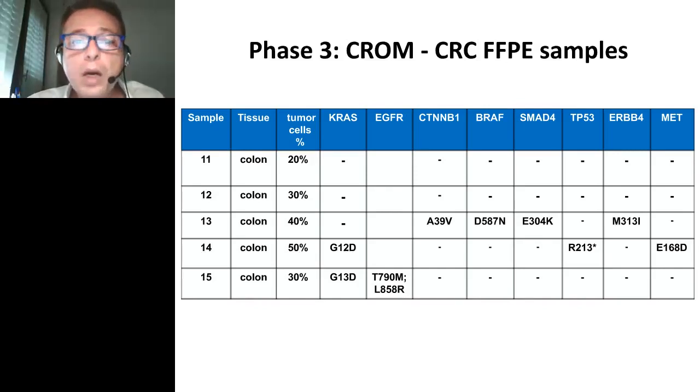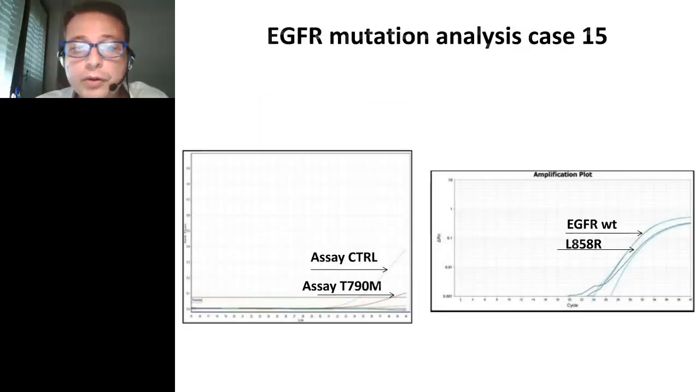Well, we were really happy about these results. However, when we analyzed the amplicon coverage, what we found is that there is a small group of amplicons for which the coverage is quite low, and this might result in a reduced sensitivity of the test. And also, on the right of this slide, there is a group of amplicons for which there is a very high coverage that is really unnecessary in this case, but might overcome the capacity of the chip, and this might lead to problems, of course, in sequencing.